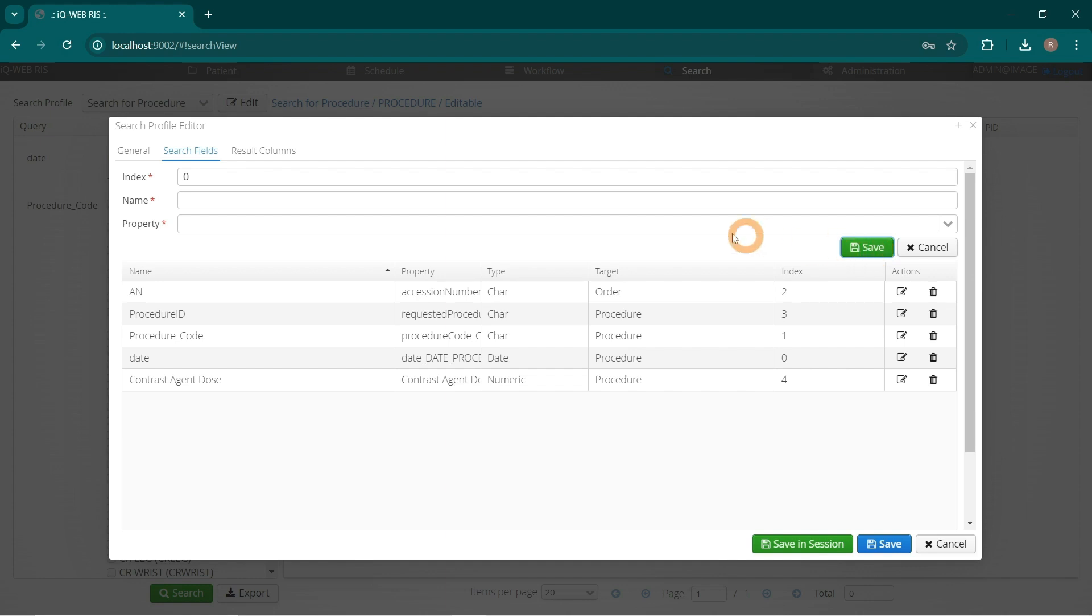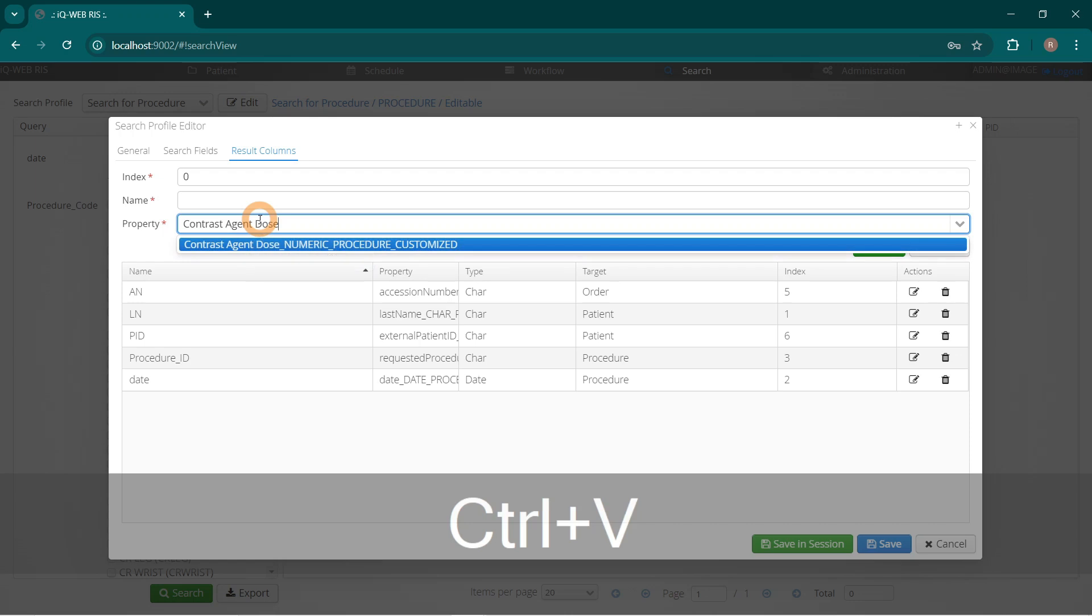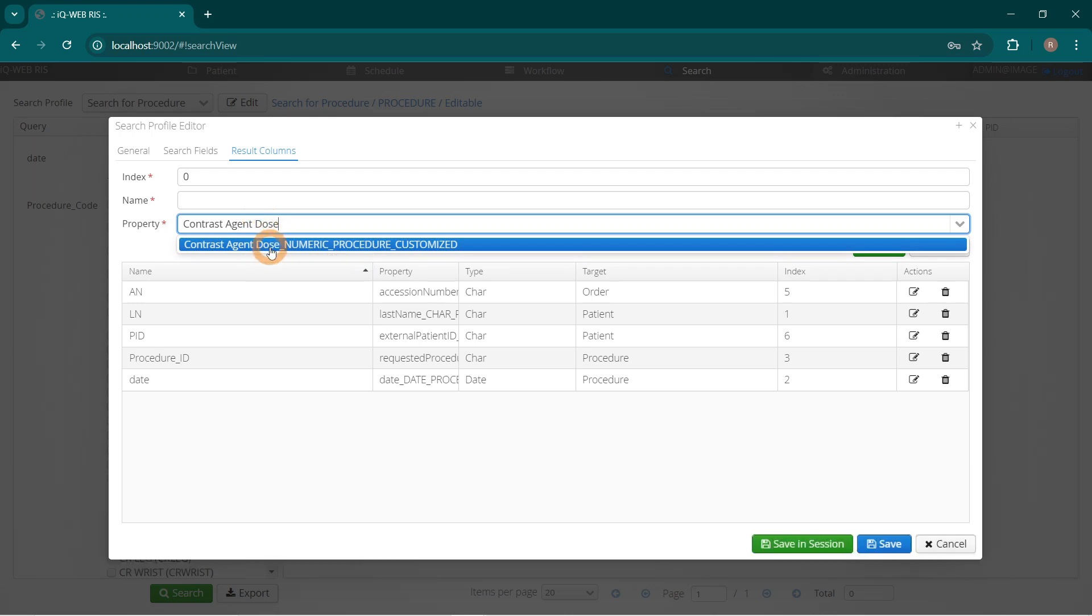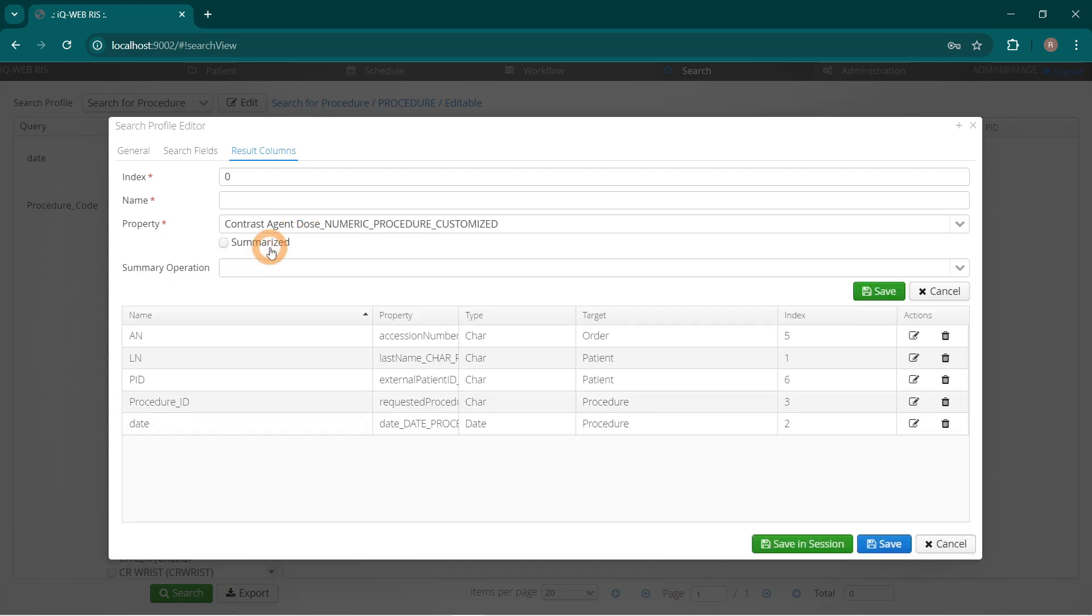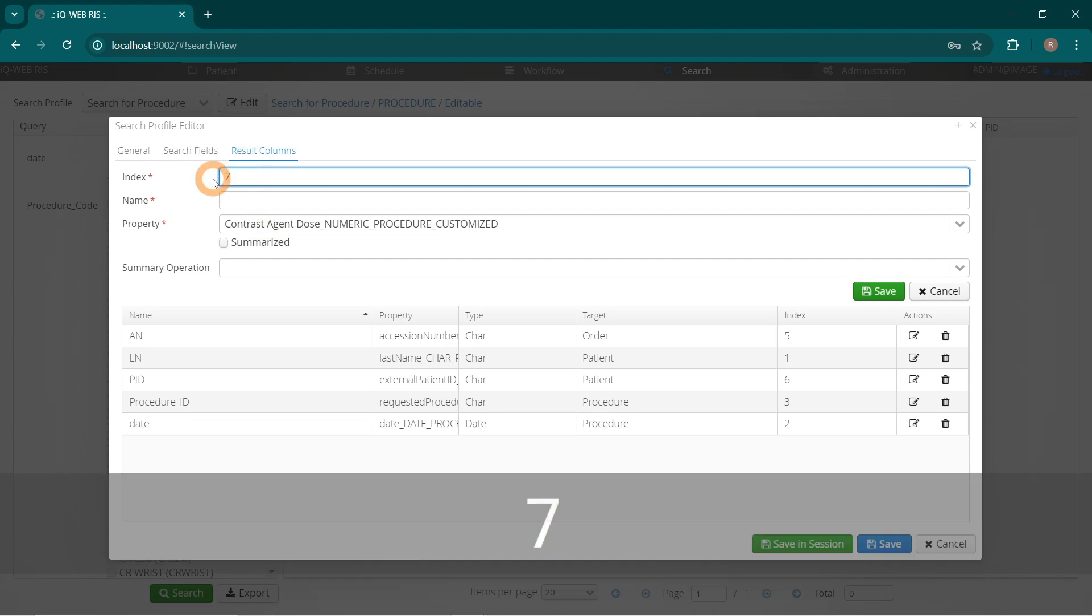Go to Result Columns. Search in Property for Contrast Agent Dose. Define index as 7 and name as Contrast Agent Dose.